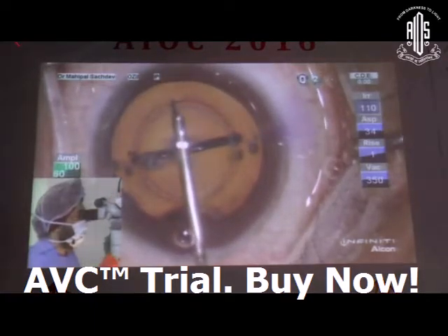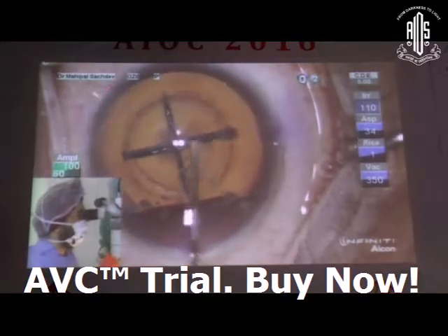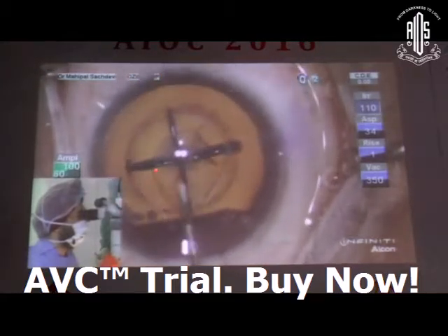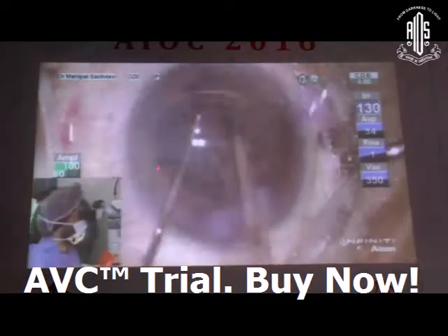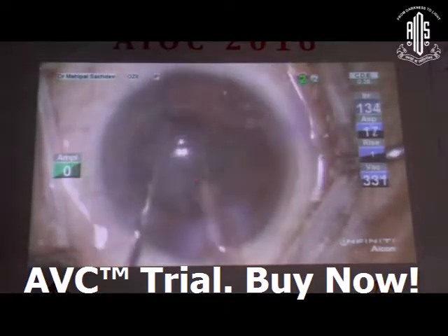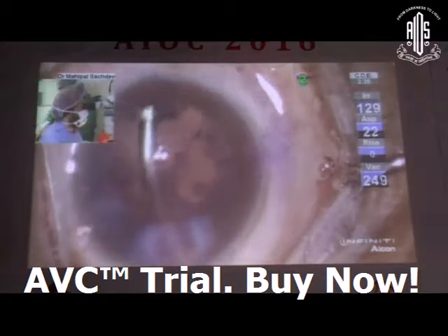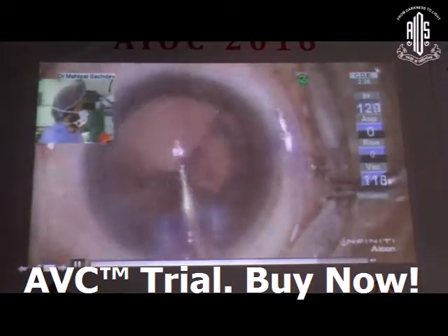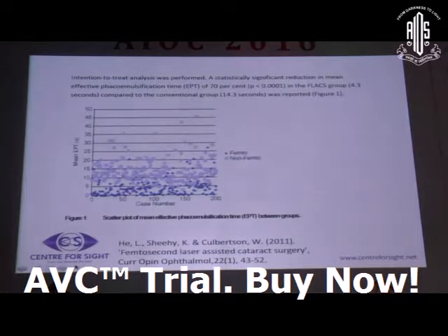If you see here, you have split the nucleus into 4 quadrants, with an almost free-floating capsulotomy. You can easily pull it out, and all you need to do, because it's a soft cataract, is break it into 4 pieces and suck out the nucleus very easily. And that is the cortex that is being taken out. So this is the first way how you would want to disassemble a nucleus, where you are not away from what you used to do in phacoemulsification.